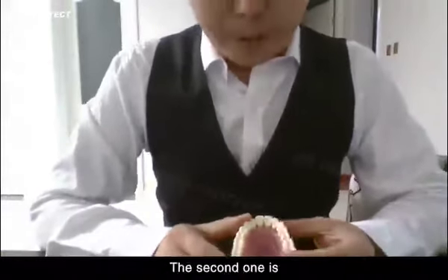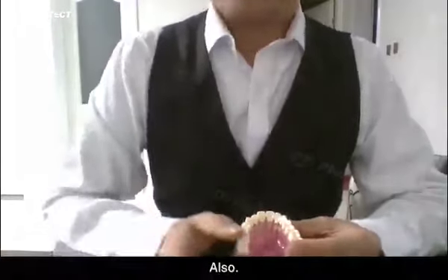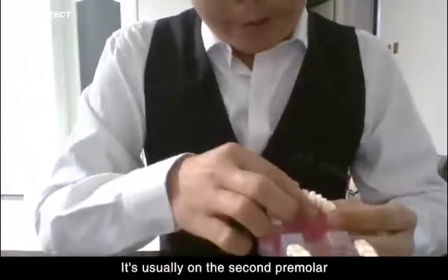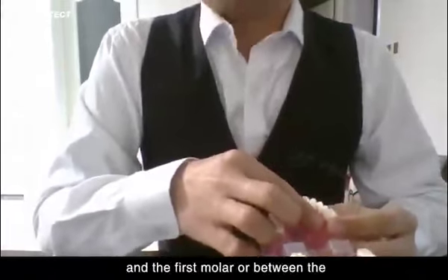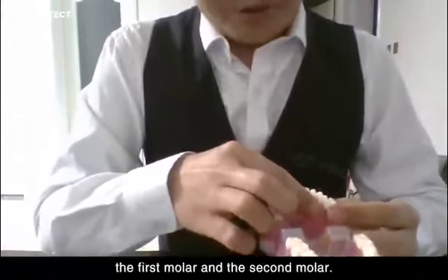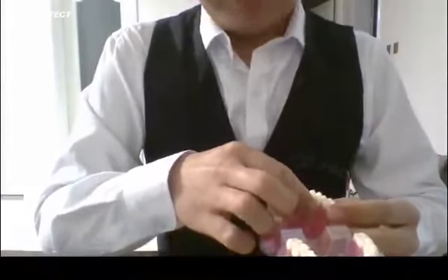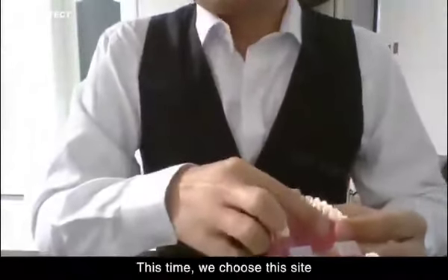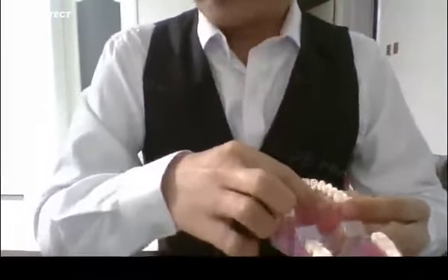The second one is the palatal bone. Also, determine the site at first. It's usually between the second premolar and the first molar, or between the first molar and the second molar. This time we choose this site between the first and second molar.